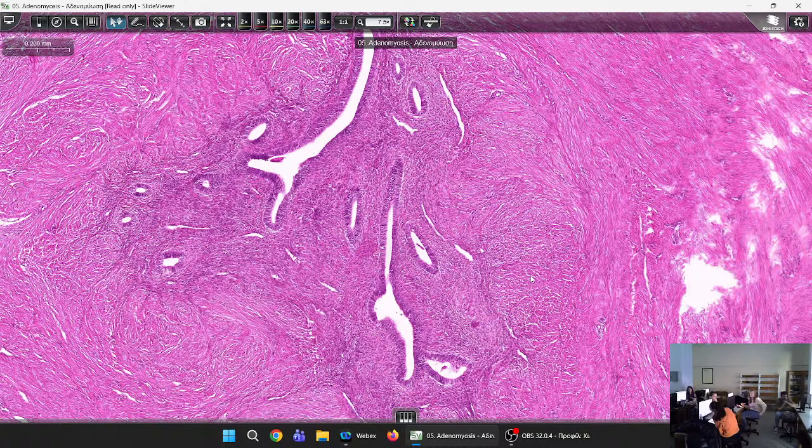That means hormone-dependent cancer of the endometrium. So in this case, that atypia is present. If you see atypical glands within the myometrium, you might think that this is invasion by an endometrioid endometrial carcinoma. No. If you see normal stroma around these glands, it's not cancer. It's just ectopic presence of endometrial tissue. So it's a benign lesion.